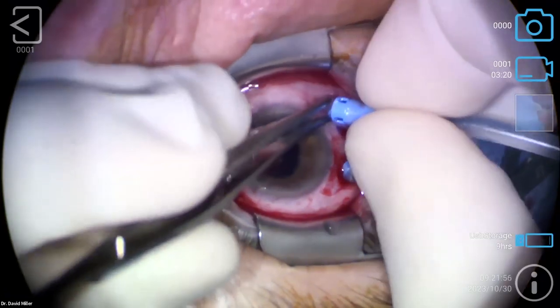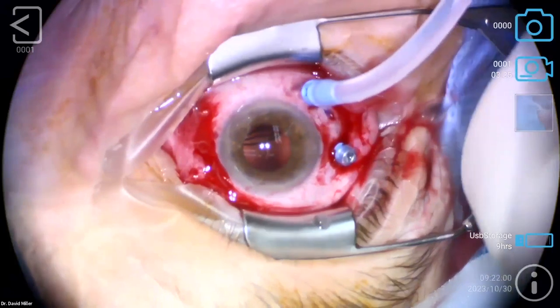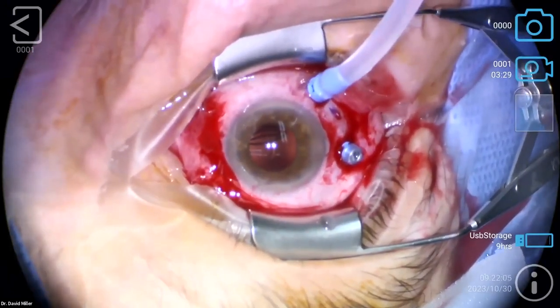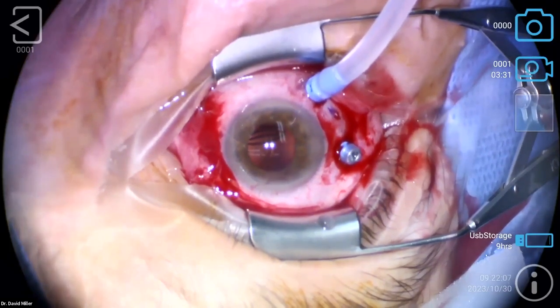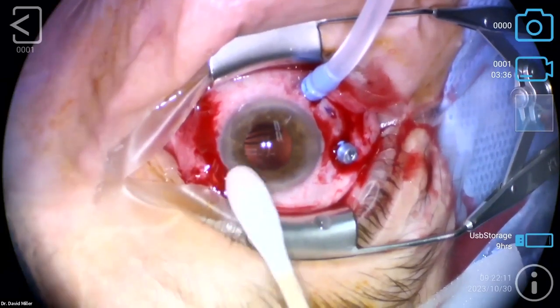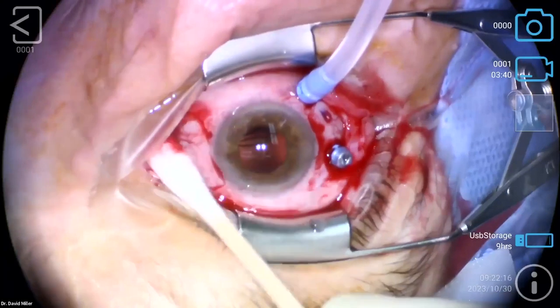This can always be your first cannula sometimes. I don't worry about it too much unless it's a prior vitrectomized eye. And now we're going to try and get ourselves directly across. I don't use a trocar marker. You know, it's just another instrument. We do have those here, but I never found it really useful. The eyeball test here in terms of symmetry works pretty well.